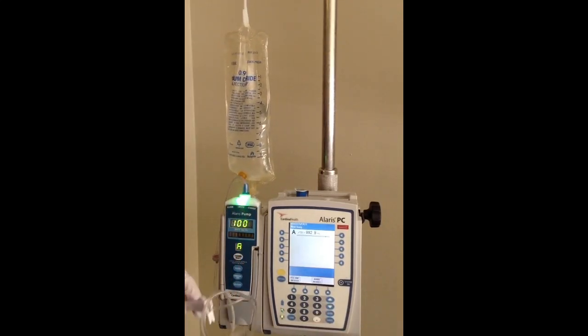The secondary tubing out of the bag actually comes unclamped, so the roller clamp is not closed at this point, and we want to leave it that way so we can avoid that error of having a clamped secondary.